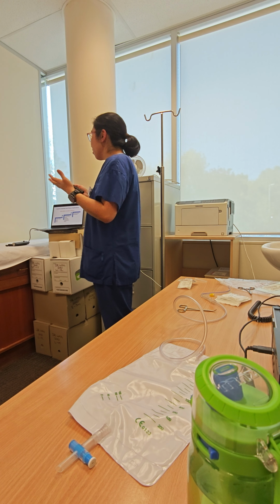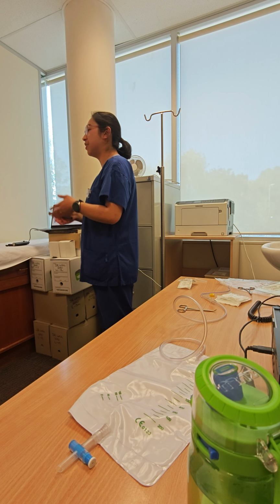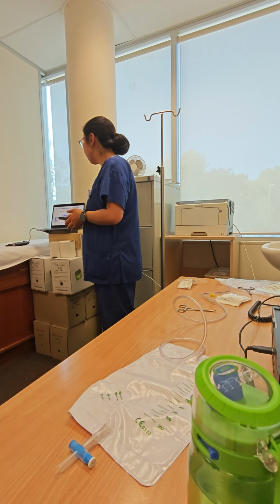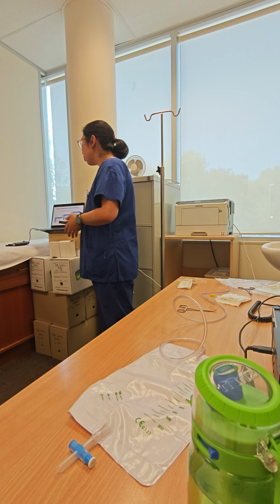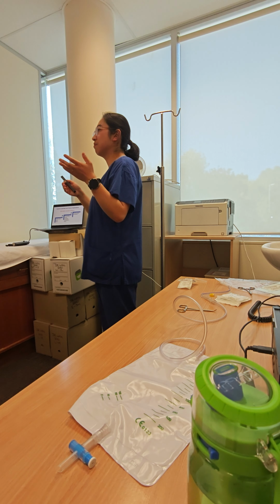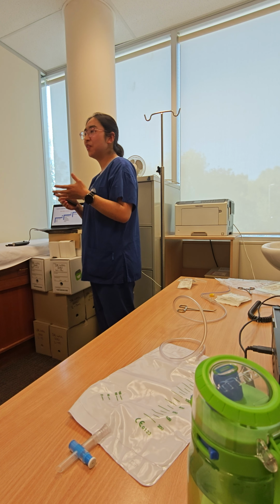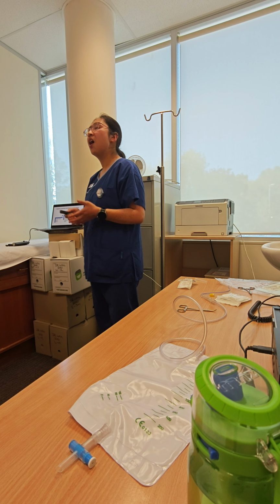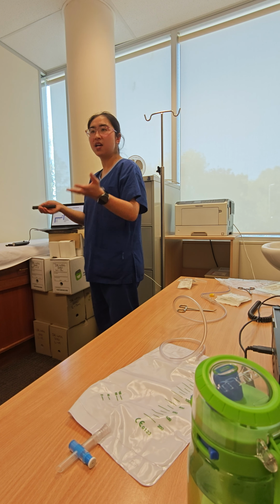Also, it's more about the communication. We need to talk to our patients to make sure they are the correct patient, correct procedure, they are safe to have the contrast, they are happy to have the procedure, and they understand what they are doing here. Also, we need to talk to our radiologists. We tell them when to start the scan. And we have different radiologists, so we understand their different habits, which makes both of us happy working together. Also, we have other radiographers. Anytime we have questions or need help, just go outside and ask for help.